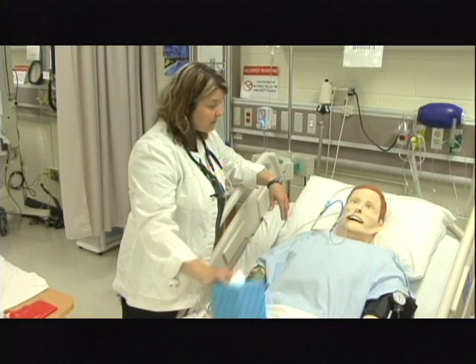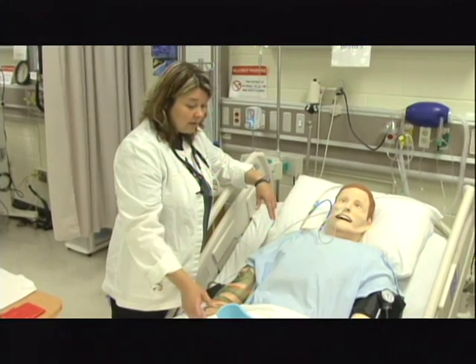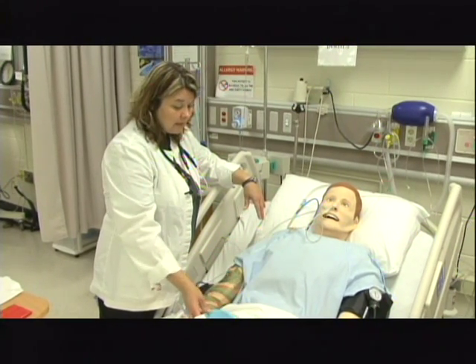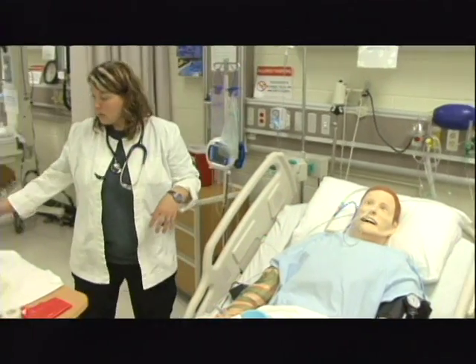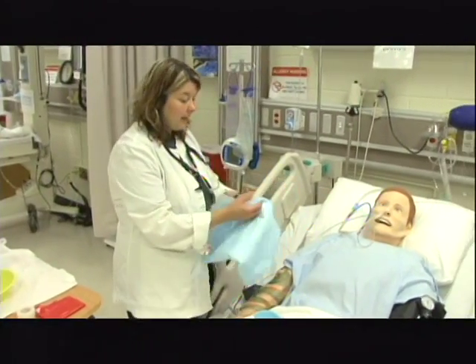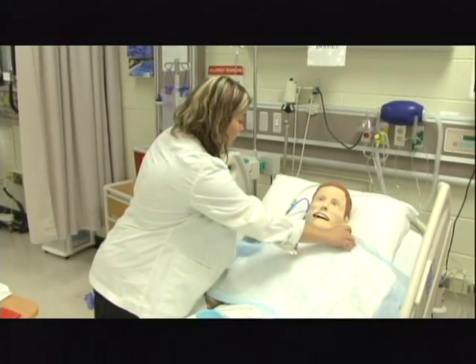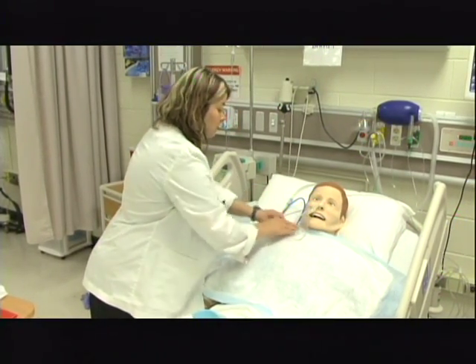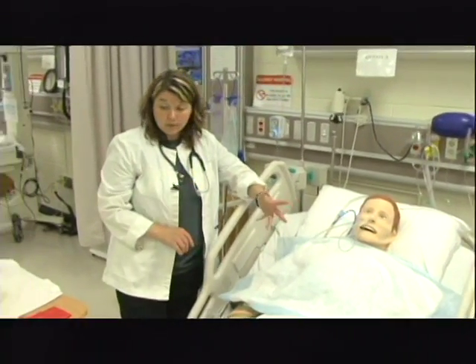I'm going to go ahead and give you some tissues here so that if you need to wipe your nose or anything as we're finished. I'm also going to put an emesis basin here because it could potentially make you get a little sick to your stomach. I'm also going to go ahead and put a waterproof pad here because I need to make sure that I don't get any of the secretions and things on him while I'm pulling this out. And then I can also use that to wrap the tube up when I'm finished.